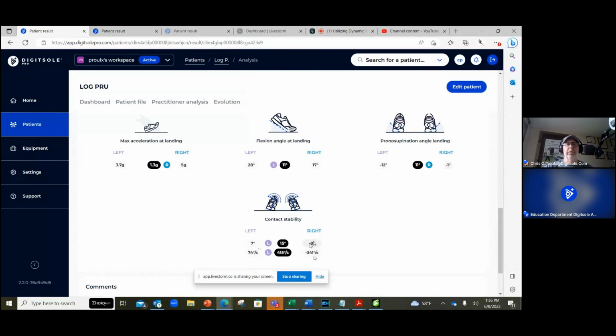Okay. So the positive or negative value tells us which direction they actually went in, right? And so we see that he did move very fast. He increased by 8 degrees. But again, even at landing, that's -9 degrees, and that's actually not a bad position. And also remember, that's not his final position.